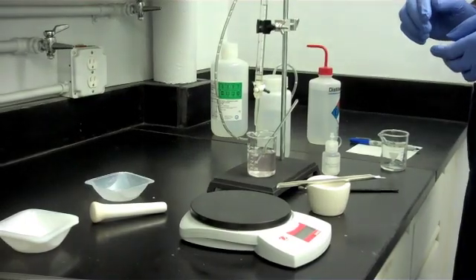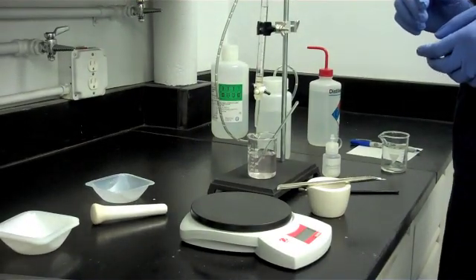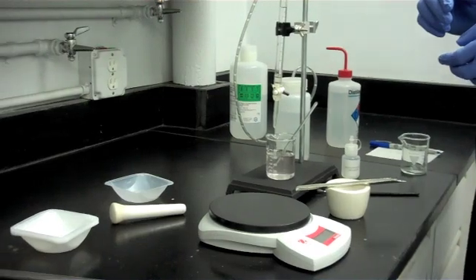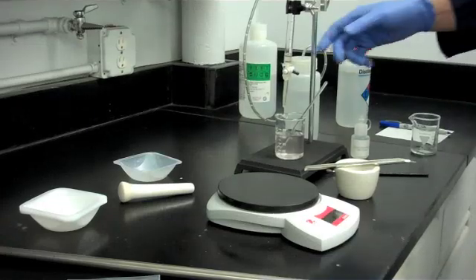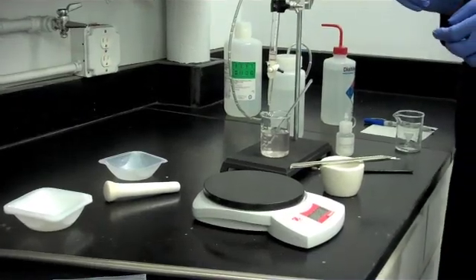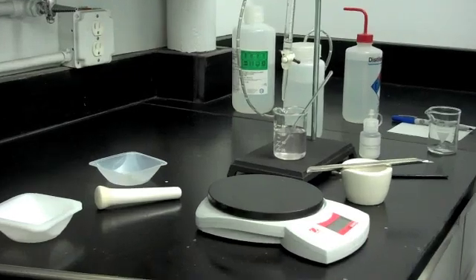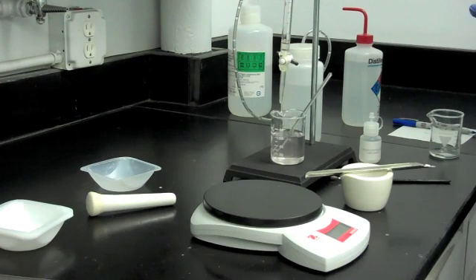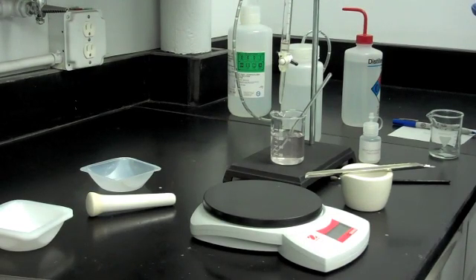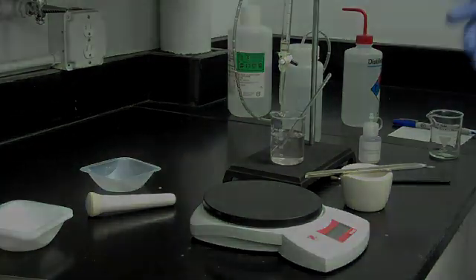Reference page 2 in the test kit for determining alkalinity and new cell test method provided with the kit to find the equation needed to calculate the percent sodium oxide. As noted earlier, if the calculated percent sodium oxide value of your sample is 0.005 or less, rectification of the bath is not needed. If the value is higher than 0.005, rectification is recommended.